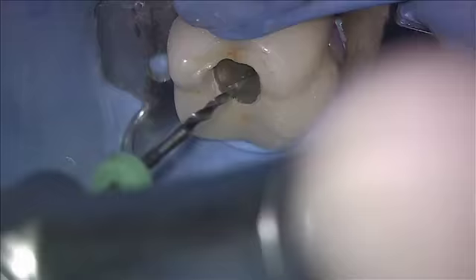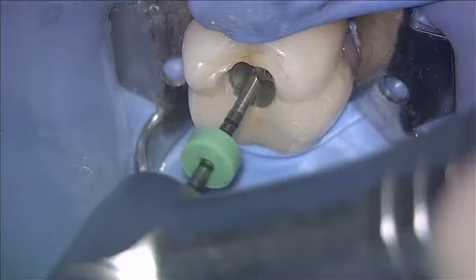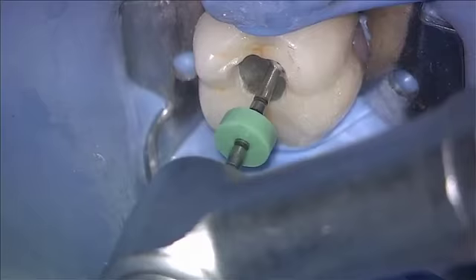I'm going to show you a very effective hybrid technique using Tulsa Dent Supply Vortex Files and GTX instruments. This is a really tight mesial buccal canal in the lower molar. We have the buccal canal on the right. This is the first instrument I've had in the root canal.